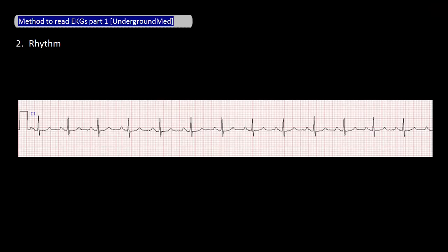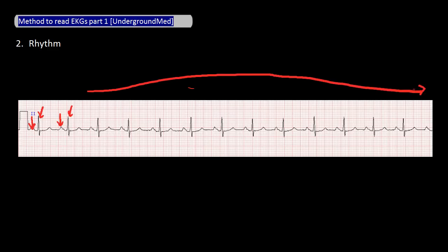Now let's focus on rhythm. You should be able to identify sinus, which is what we call a normal rhythm, or not sinus. Just like with rate, use the rhythm strip to look at rhythm. To be sinus rhythm, each P wave should be followed by a single QRS complex. Notice P wave followed by a QRS, another P wave followed by a QRS. You continue to see each P wave followed by a single QRS, giving us a sinus rhythm.